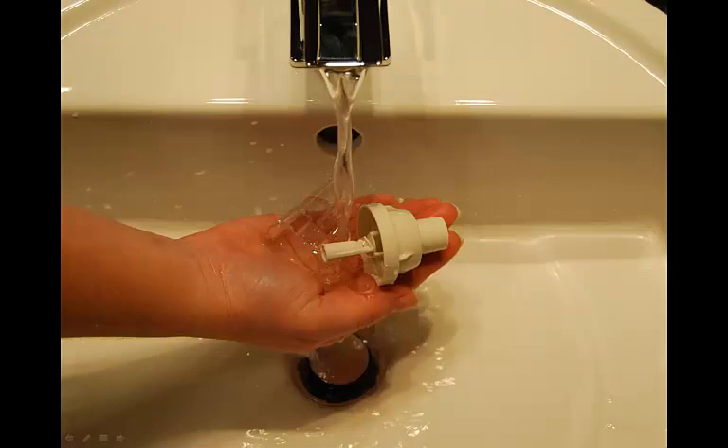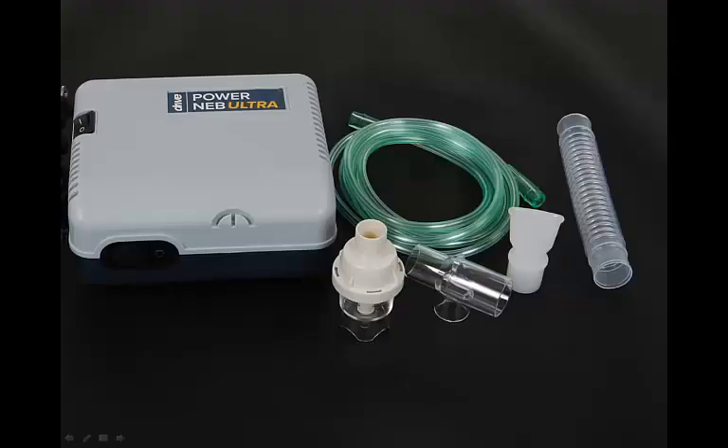Rinse under hot tap water for 30 seconds to remove detergent residue. Permit all parts to air dry. Each day, disinfect the nebulizer medicine cup assembly, except for the tubing, by soaking the items in three parts hot water and one part white vinegar for a total of 30 minutes. Or, you may use a medical bacterial germicidal disinfectant available through your provider. If using such a disinfectant, be sure to follow the manufacturer's instructions carefully.